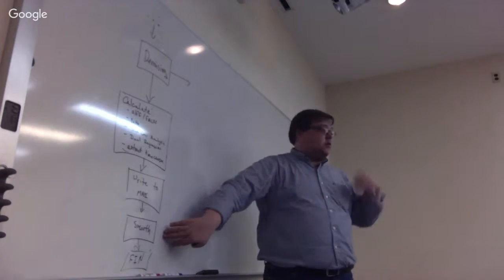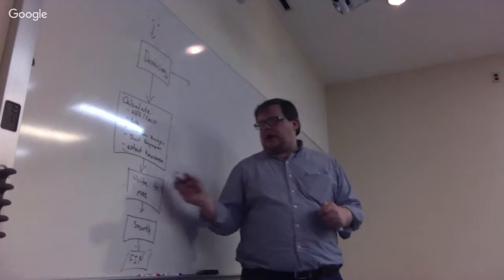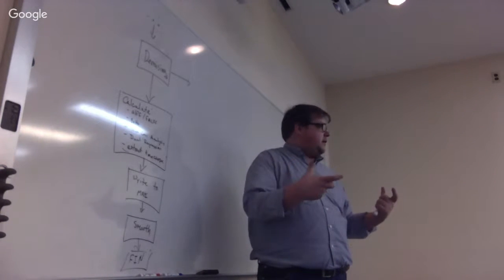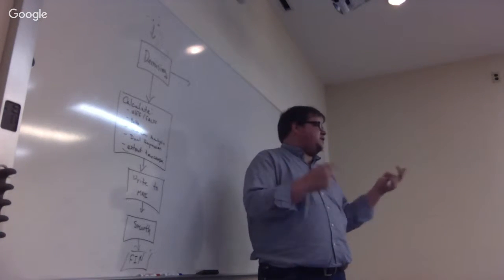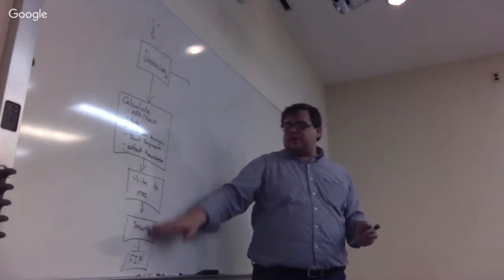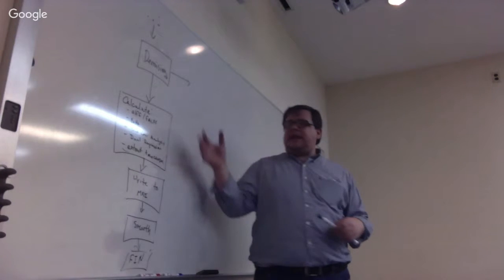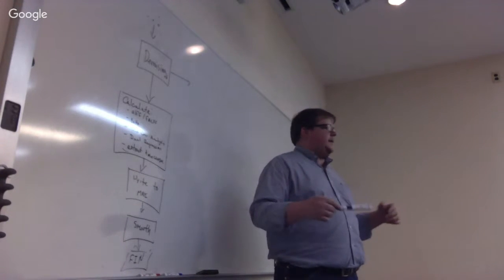And smoothing does the exact same thing, but more intentionally, right? And so that process will tend to increase the amount of correlation, so it'll make the blobs bigger, right? Which could adversely affect the spatial specificity of what you're interested in seeing, right? But what we found is if you do this stuff afterwards, it affects it less, right? And the nature of the measures allows us to calculate in the original space, so we do it, right?